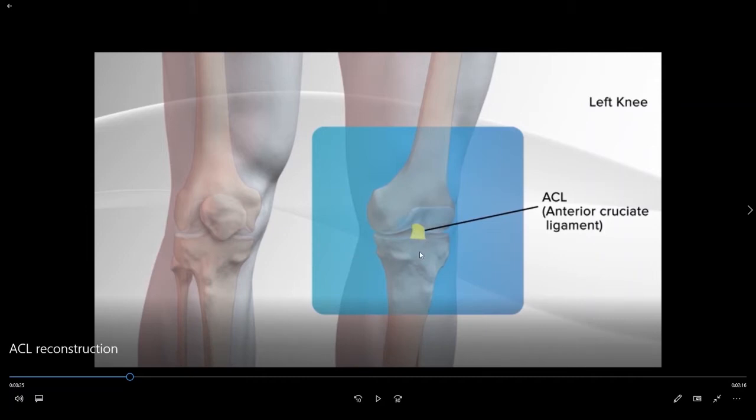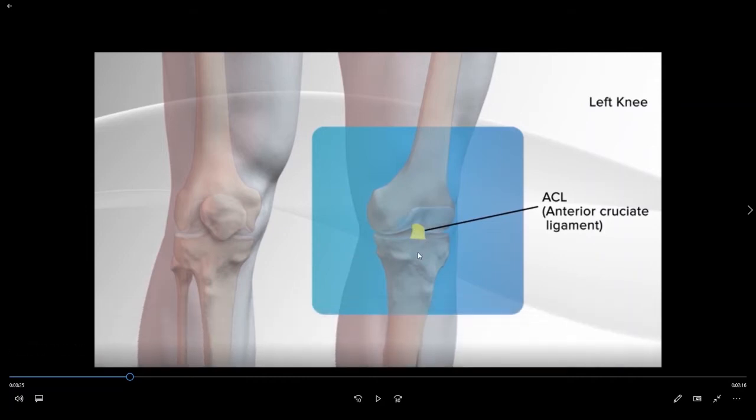When patients suffer an anterior cruciate ligament tear they lose the function of that ligament, which requires us to go in and reconstruct the ACL. In this particular surgical animation we are going to use a hamstring tendon autograft to reconstruct the ACL.